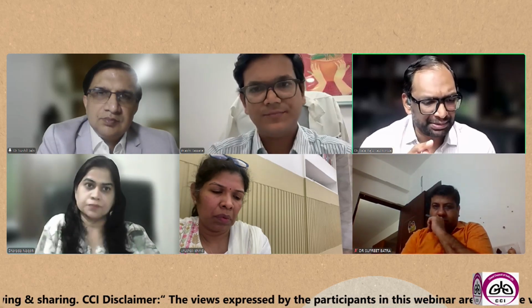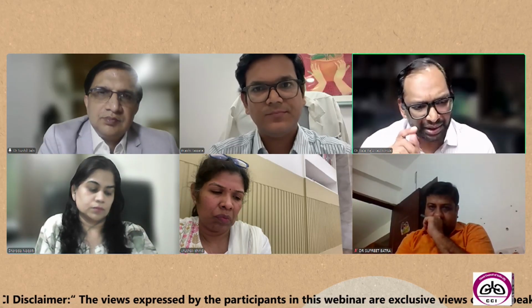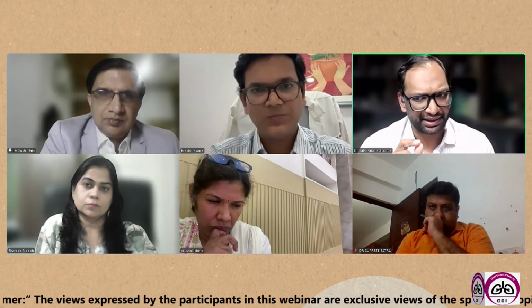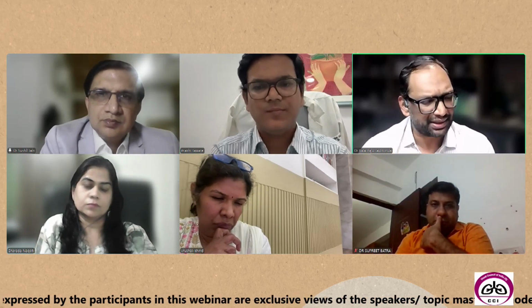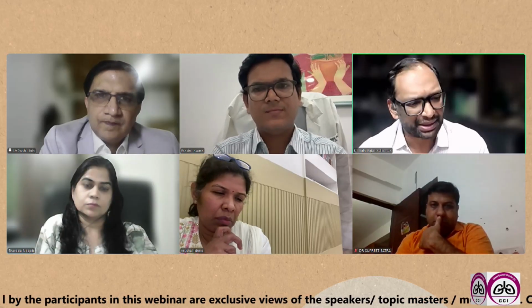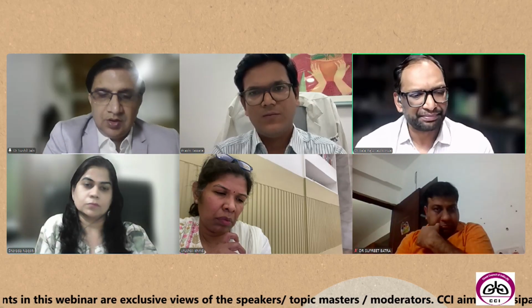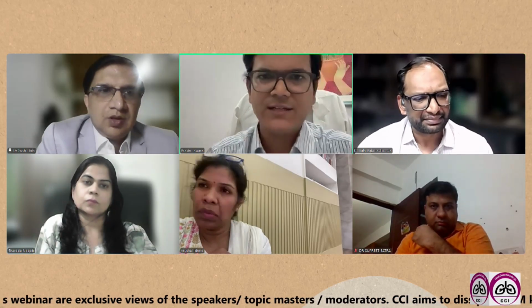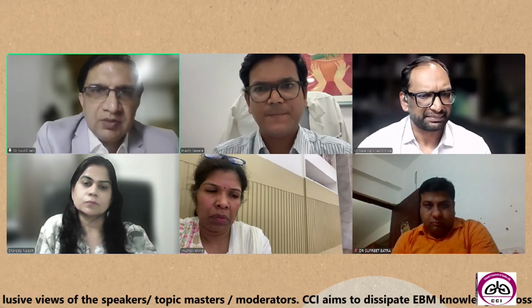So this point has been mentioned, the motion artifact which comes with deep respiration, you are not able to puncture the lymph node at the exact site. Only in those cases, I might require general anesthesia. Otherwise, at least 95% of the times, we don't require general anesthesia at all. And also for staging, sometimes we do it under general. If the procedure is getting prolonged, then yes, sometimes we do it.